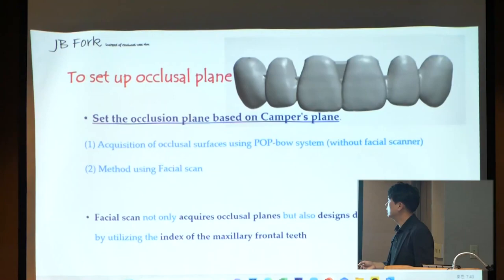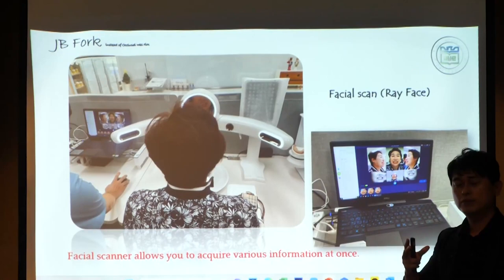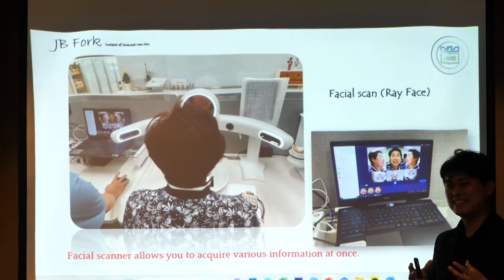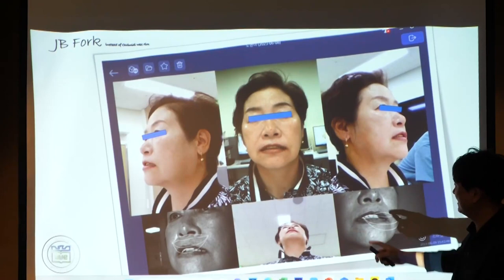So this is a very simple patient scan. Anyway, biting and then inserting the JB fork. At that time, the patient has the six teeth already, right? So she can smile. So this is the JB fork, not natural teeth. After putting in the JB fork, she smiles, and then we take a photo.